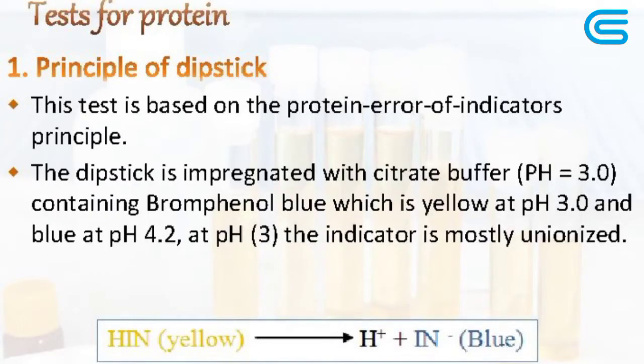do some boiling method. When we are using the reagent strip method, it uses a specific principle. The reagent area for the protein component is coated with the bromophenol blue indicator and buffered to an acid pH, which changes color in the presence of proteins.